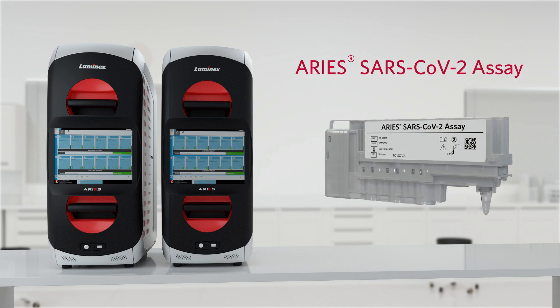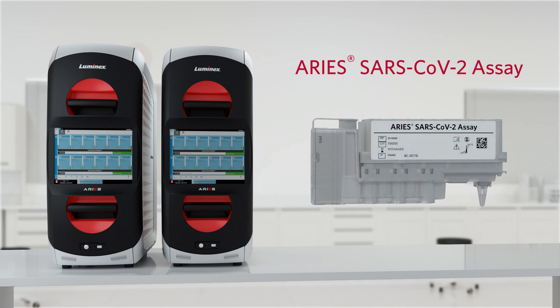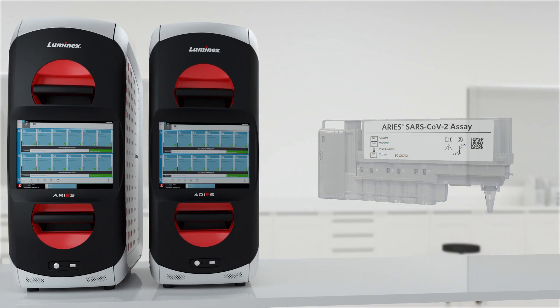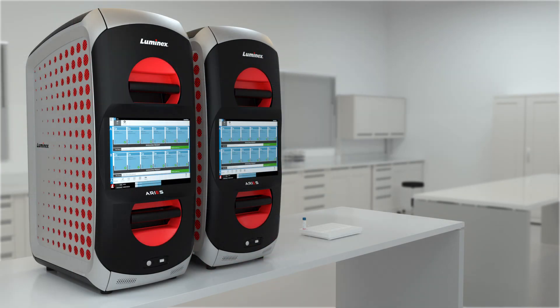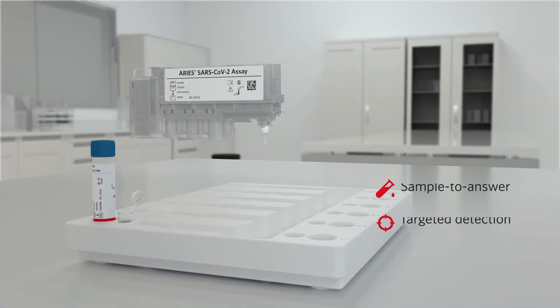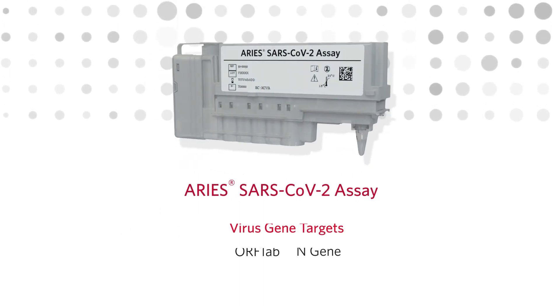In response to the global outbreak of the novel coronavirus disease, Luminix has developed and received emergency use authorization for the ARIES SARS-CoV-2 assay. Designed for use on the ARIES system, the ARIES SARS-CoV-2 assay is a moderate complexity sample-to-answer test that enables targeted SARS-CoV-2 detection using two genes.